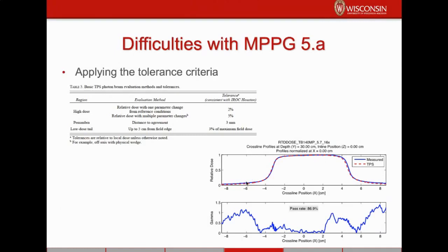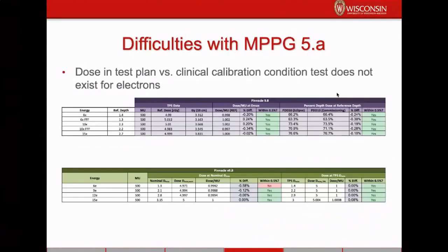Different tolerance criteria, and doing this in an automated, efficient way is challenging. In a little bit, I'll discuss some of the tools we developed to help with this. But this is one thing that, when we first started doing this type of work and analyzing these profiles, it wasn't immediately obvious to us how to do the analysis in a systematic, efficient way.